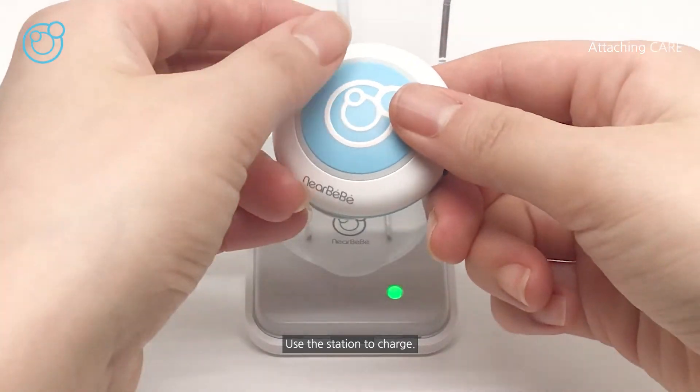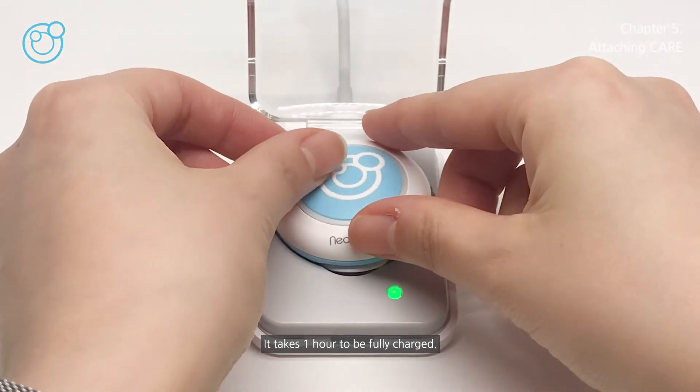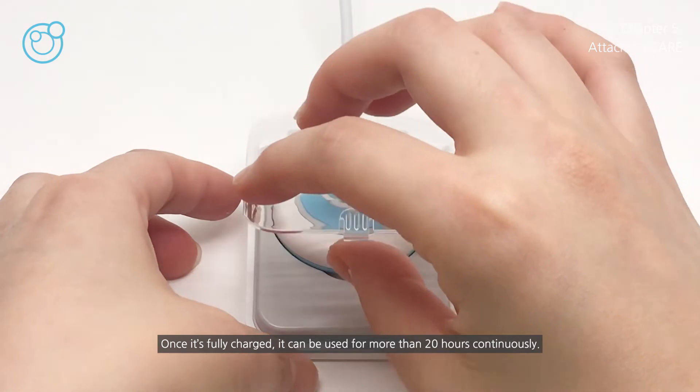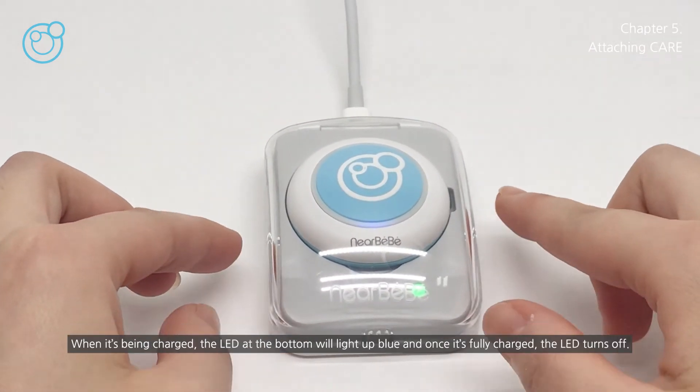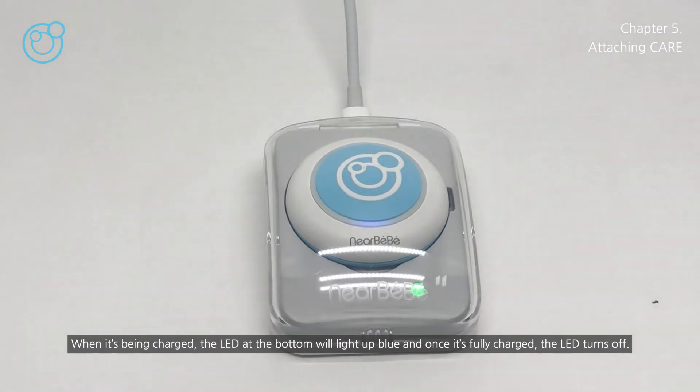Use the station to charge care. It takes one hour to be fully charged, and once fully charged, it can be used for more than 20 hours continuously. When it's being charged, the LED at the bottom will light up blue, and once it's fully charged, the LED turns off.